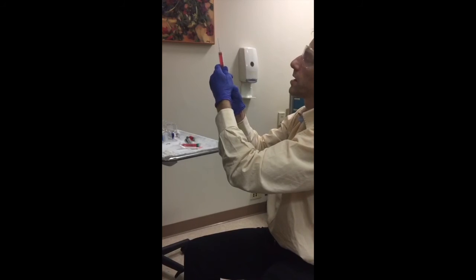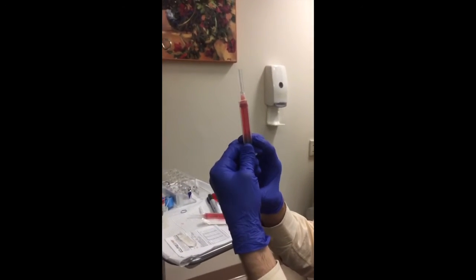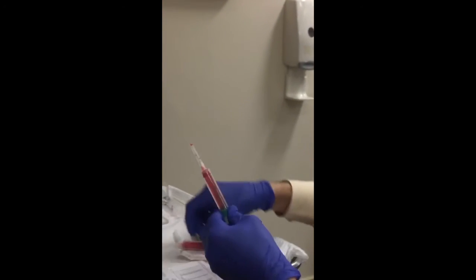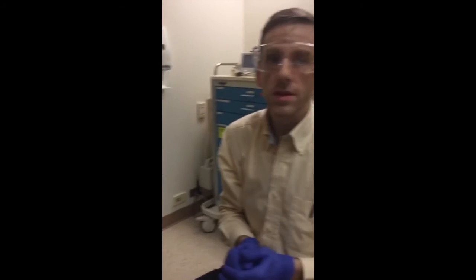Now you are left with two syringes. Keep the cap on when you push the air out — if any blood spurts, it spurts into the cap and not into your eyes. Now you have two PRPs ready to inject into the patient's scalp.